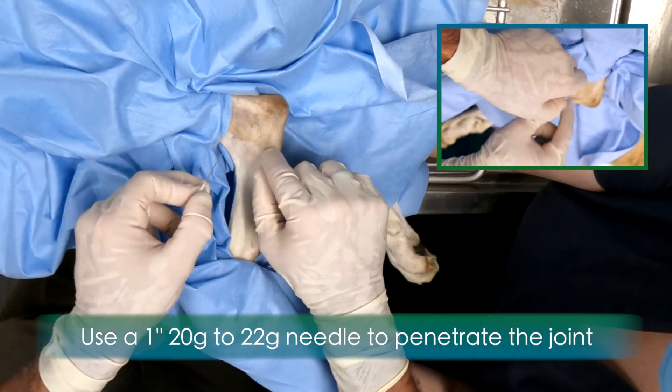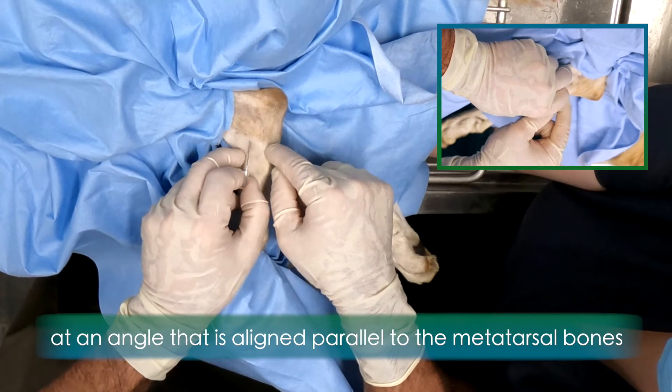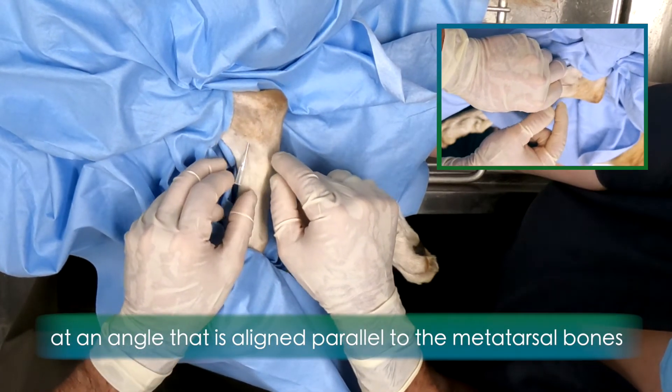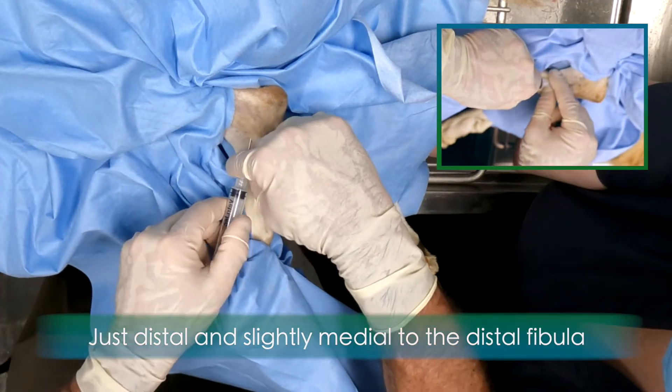Use a 1 inch, 20 or 22 gauge needle to penetrate the joint at an angle that is aligned parallel to the metatarsal bones, just distal and slightly medial to the distal fibula.